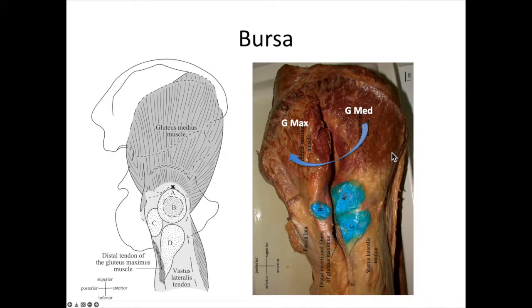If you flip the gluteus maximus open, you can see different bursae here, but functionally, from my injection study, it basically just behaves as one bursa. And this is the bursa that people would like to inject, and we call it the subgluteus maximus bursa.